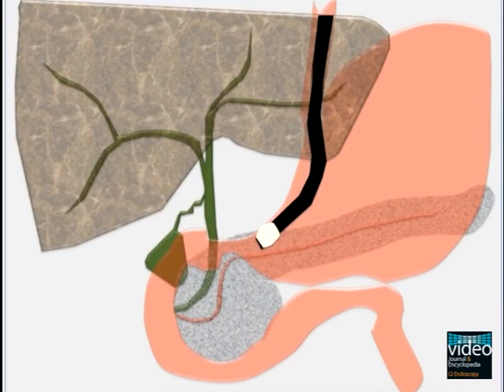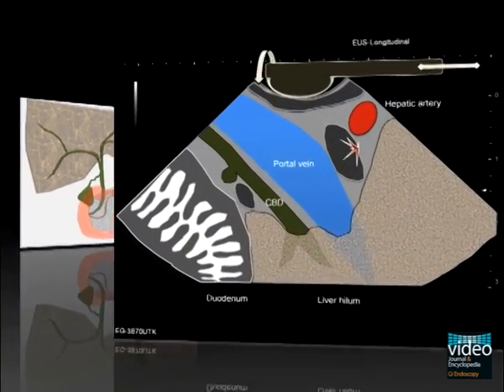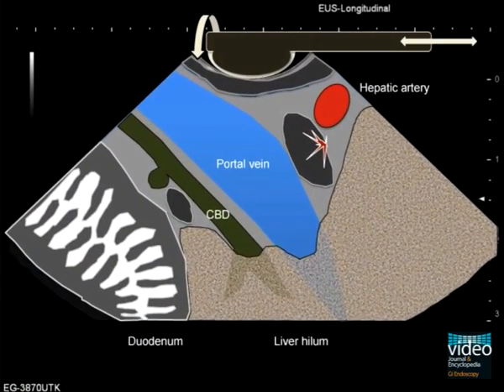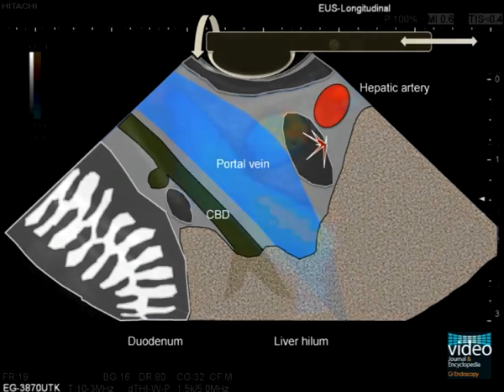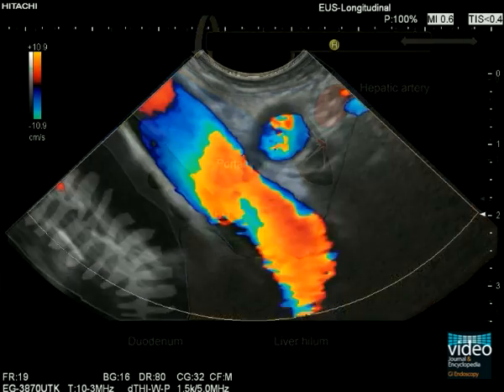By further withdrawing the scope, it will slip into the stomach. In the gastric antrum, we get an excellent view on the structures of the liver hilum with the common hepatic duct, the extrahepatic portal vein, the common hepatic artery, and the normal lymph nodes of the liver hilum. Color-coded duplex scanning facilitates correct identification of these anatomical structures.